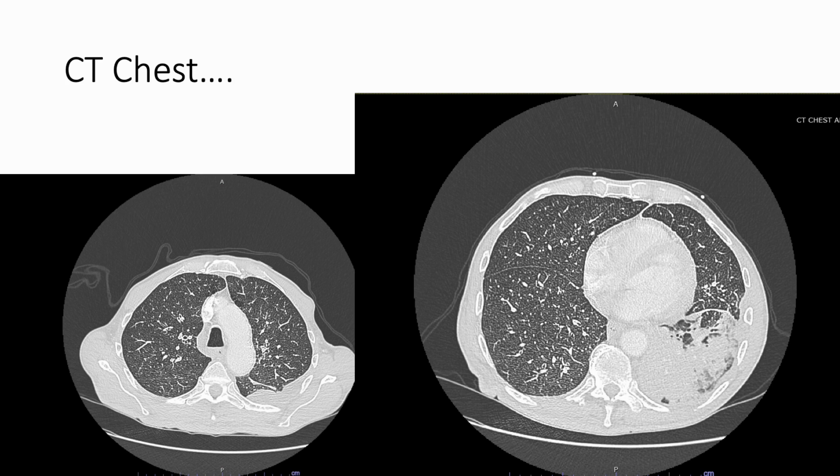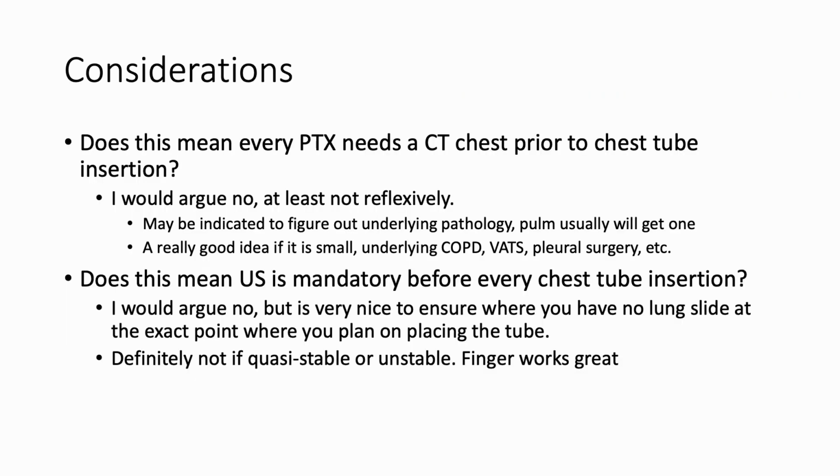So I put the needle down and we got a CT, which of course showed no pneumothorax, just advanced emphysema, left lower lobe infiltrate, and really no blebs, nothing else that would necessarily fool us on chest x-ray. So I thought this was an interesting case because I was seconds away from putting a chest tube into a patient who didn't have a pneumothorax, and without ultrasound, I probably would have wound up on some board panel or in front of somebody else angry at me. And so this was a great teaching case, I thought, to share with the group.